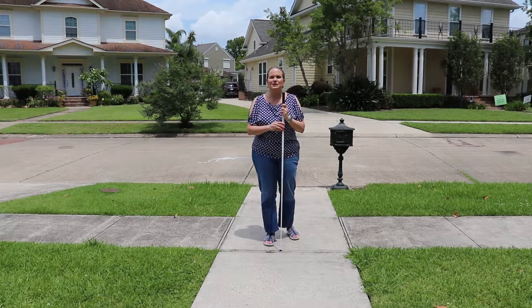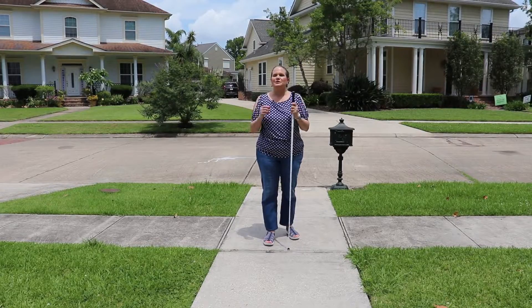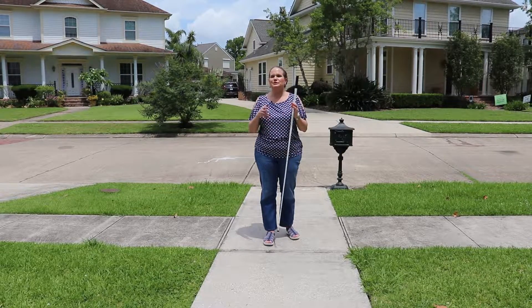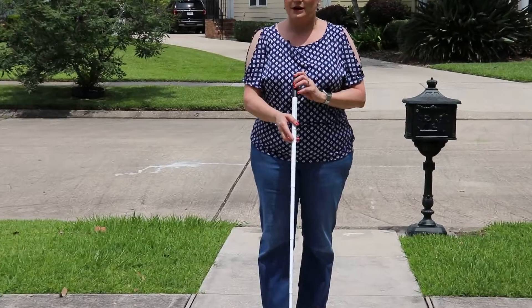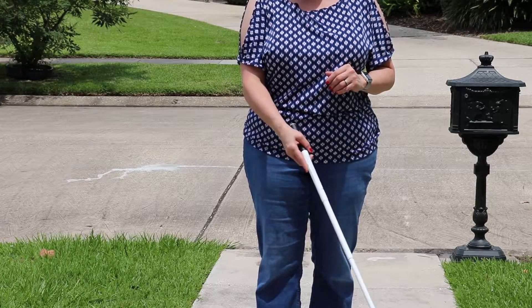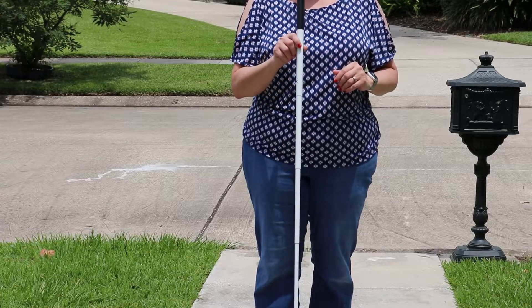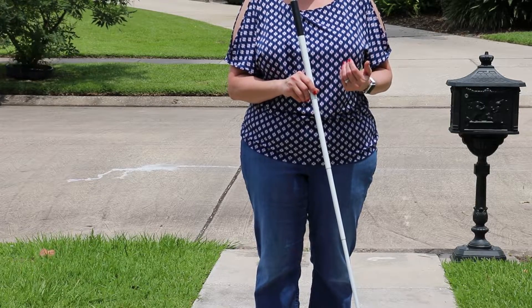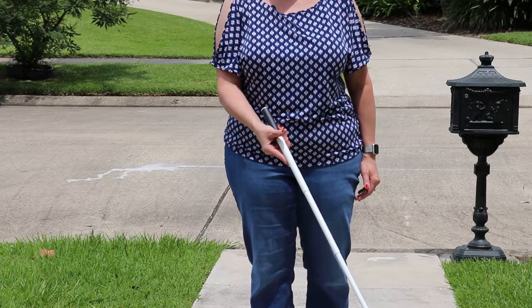First you meet with an Orientation and Mobility Specialist who will assess you to determine the appropriate length for the cane and what you need to use it to do. Then you'll have a conversation about whether you should use a rigid cane or one that folds up. There are many different ways you can use a cane to get information in the world around you, but it all boils down to how you grip and swing the cane. Many people like the structure and feel of using the common golf grip or handshake grip when going through unfamiliar territory. However, if you're in a crowd, you might prefer to use a pencil grip that brings the cane closer into your body. And if you're in unfamiliar territory and want to explore, having more of an open palm grip can help you get valuable information.